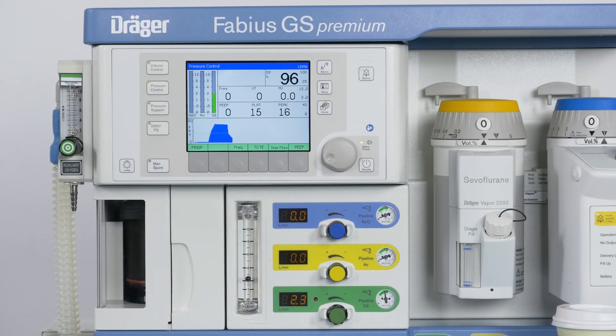You simply press the key to adjust the ventilation parameters and confirm via the rotary knob.